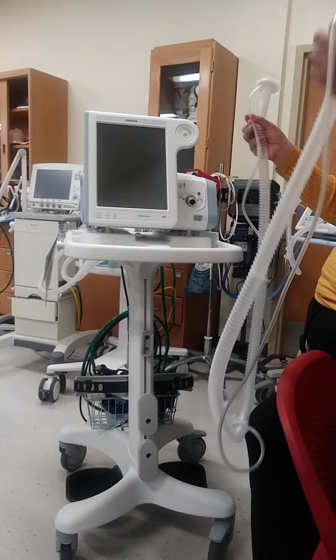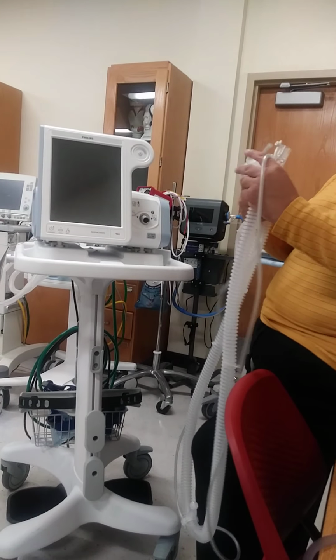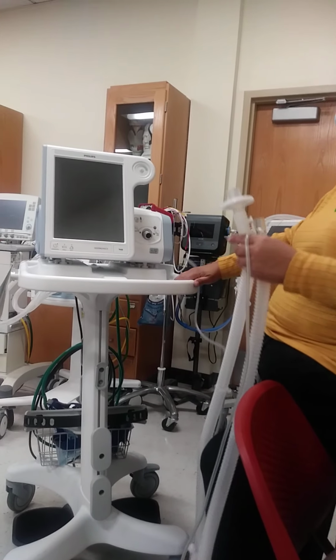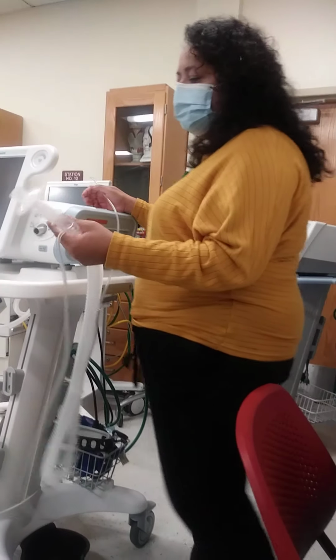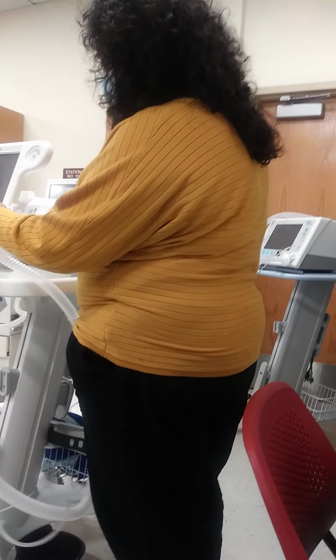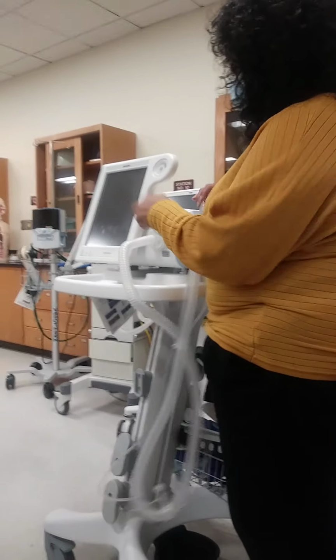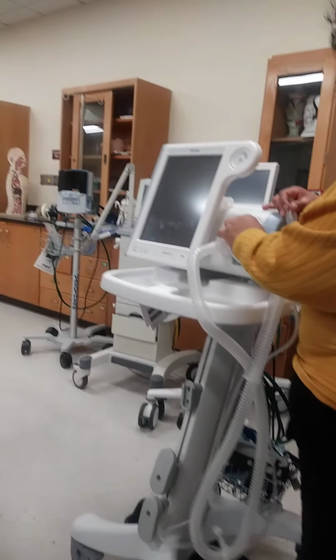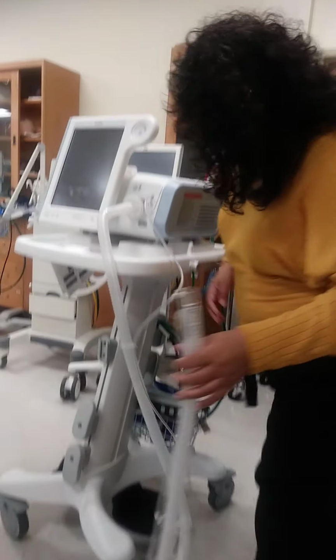So this is an exhalation port. This is just some additional tubing for your pressure, and then here's a bacteria filter that it comes with, okay? And so the way it works is you put your bacteria filter this way right here. This little device, this little tubing goes right over here. And then this is where the mask would go.